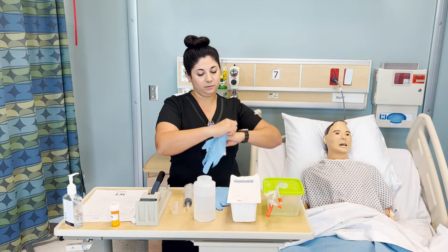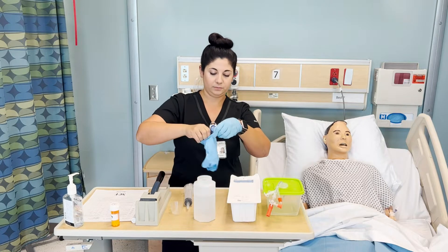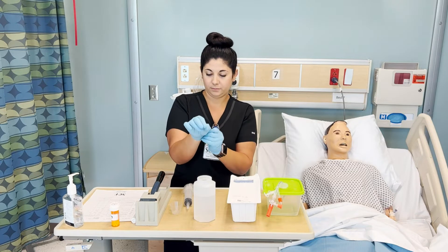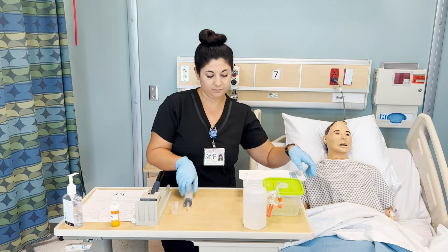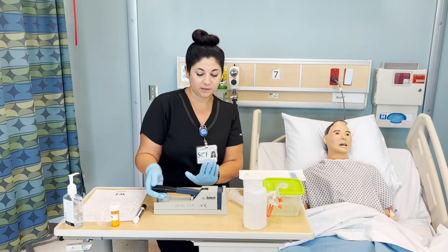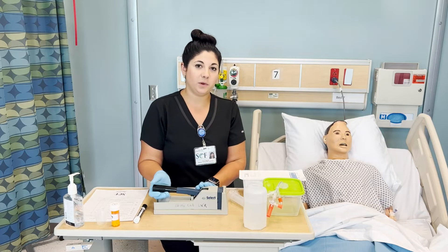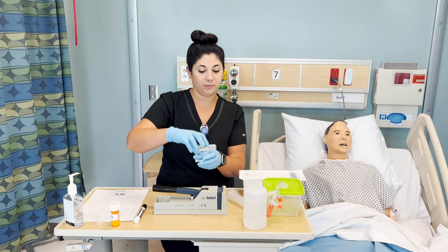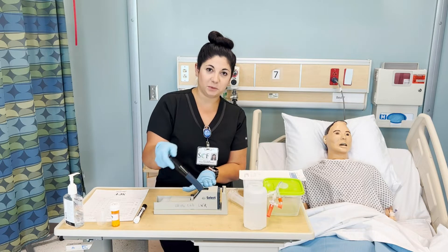I'm going to put gloves on. And we will crush our medication. This is one option for a medication crusher — there are a lot of them. Some hospitals now have individual crushing mechanisms where you just twist it onto or into a capsule area. This is an old school one, but this is what you'll use here.